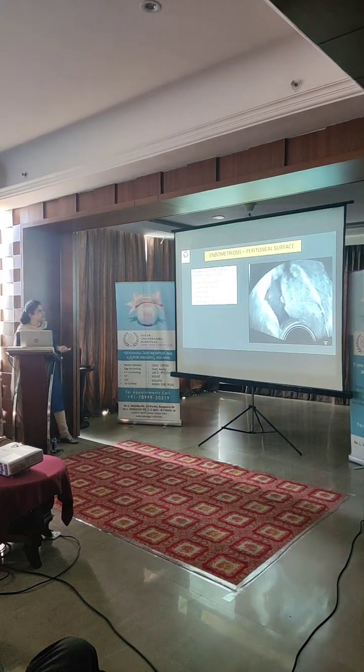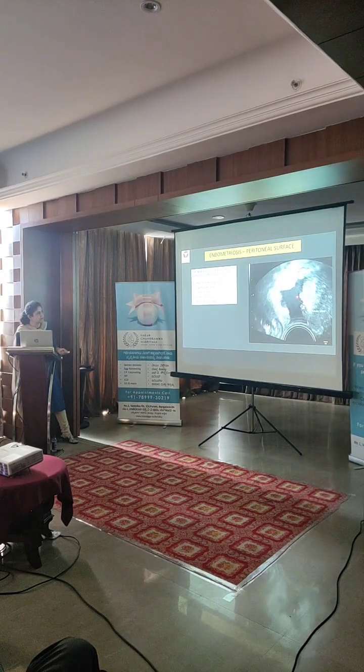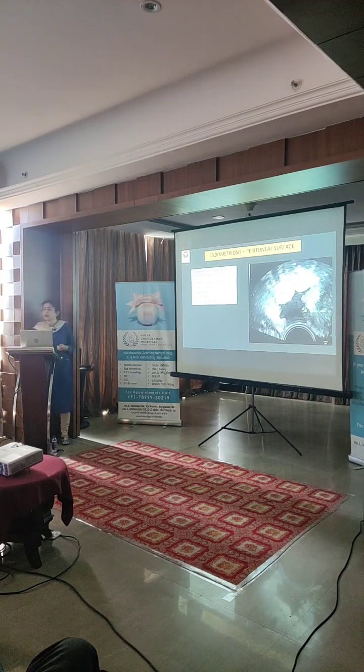Okay, so here you can see this. You can look at the serosal surface of the uterus, some turbid fluid. Can you see those hyperechoic projections, flimsy adhesions, peritoneal pockets? These are all features.